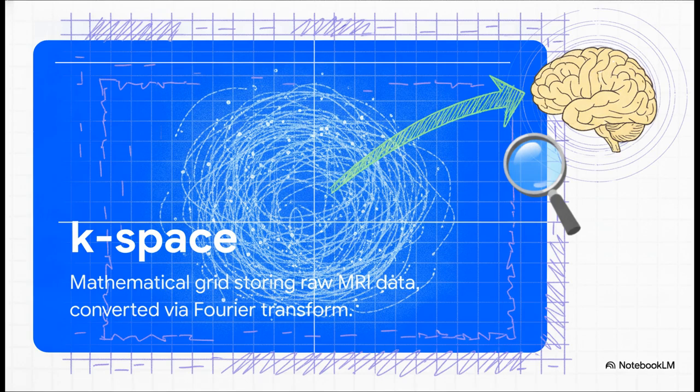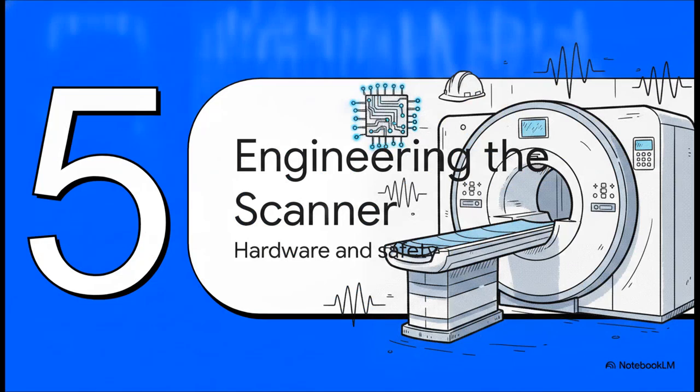Finally, the scanner's computers apply a 2D Fourier transform to this grid, elegantly taking this invisible ocean of raw frequencies and phases and calculating the stunning, high-resolution diagnostic images that doctors rely on every single day. Section 5. Engineering the scanner, extreme hardware, and strict safety protocols.